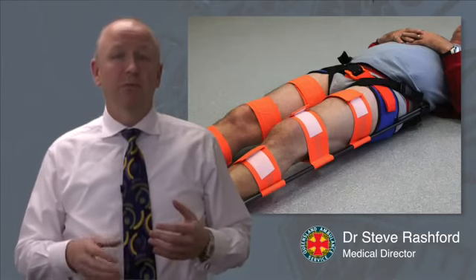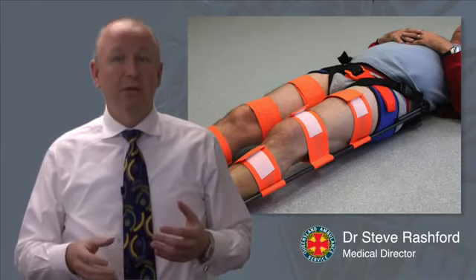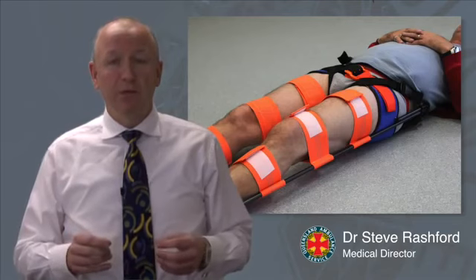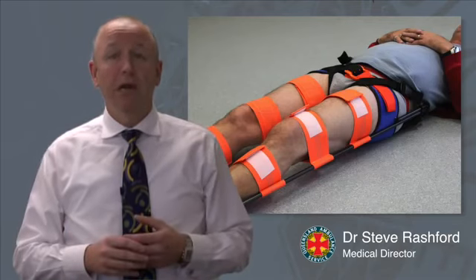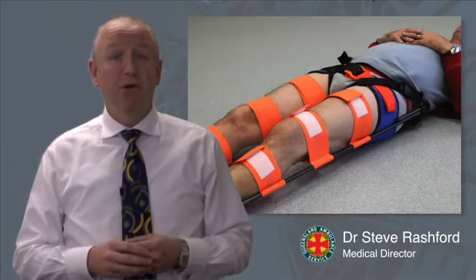It's important to do it in that order. Remember, you're more likely to bleed to death from a fractured pelvis initially than from a femur. But addressing the femoral fracture is very important because it reduces long-term morbidity and mortality, especially when applied early. So it is a priority of care.